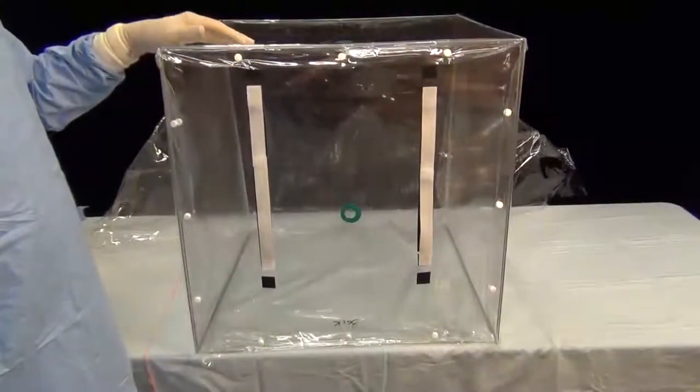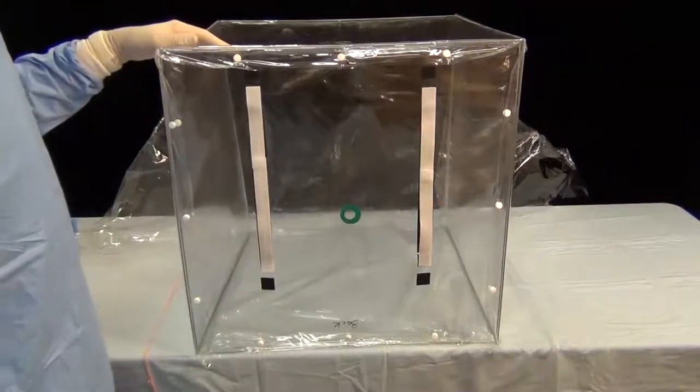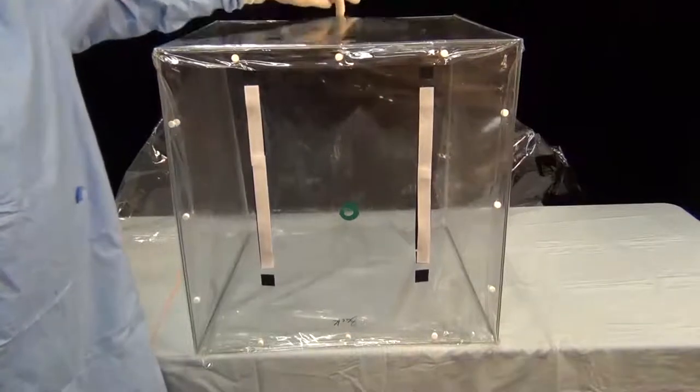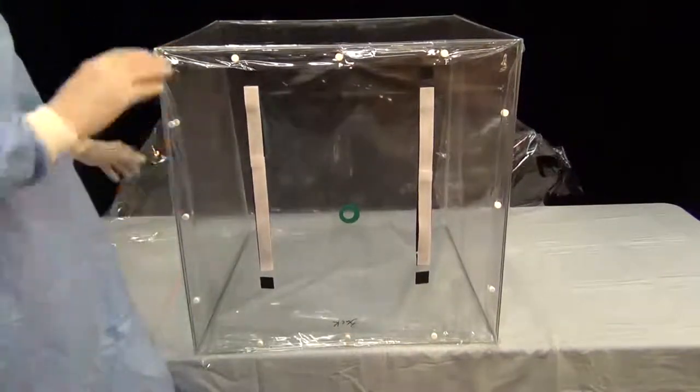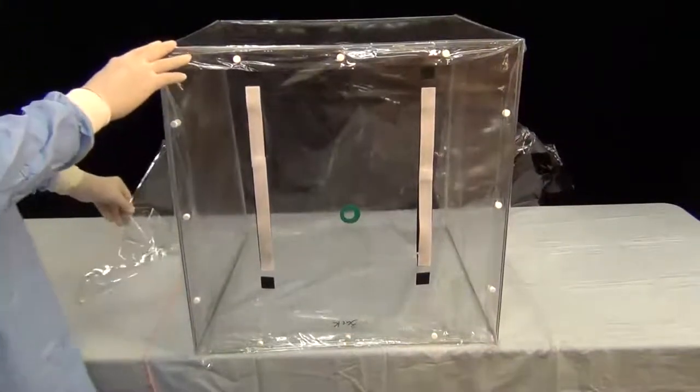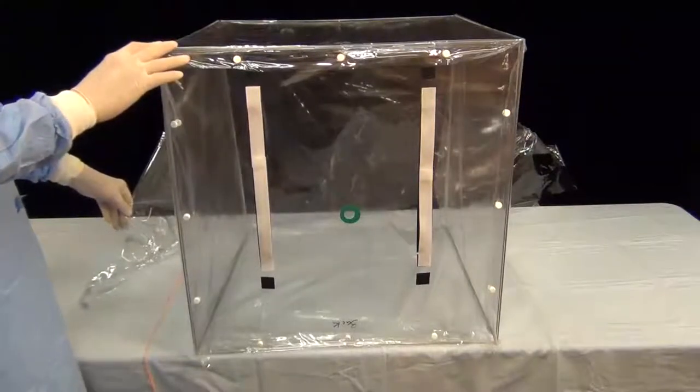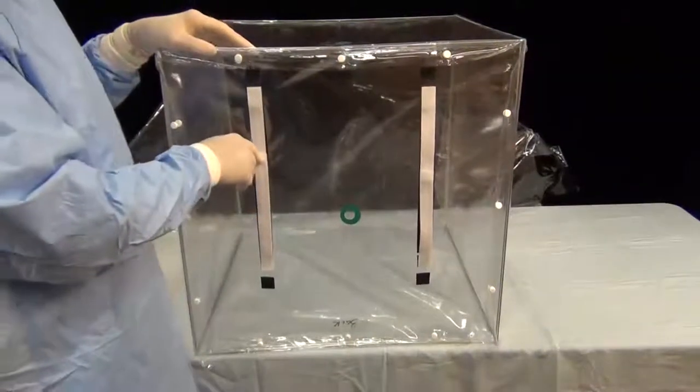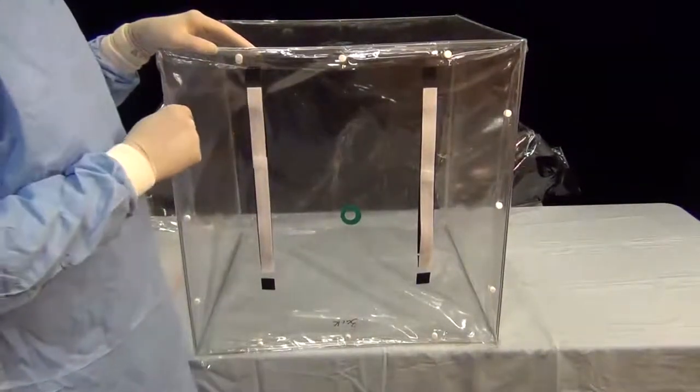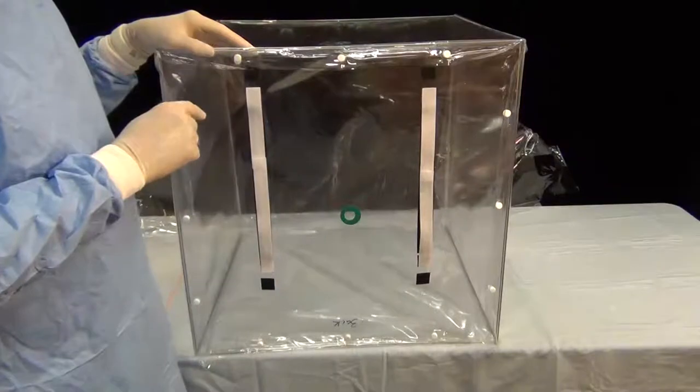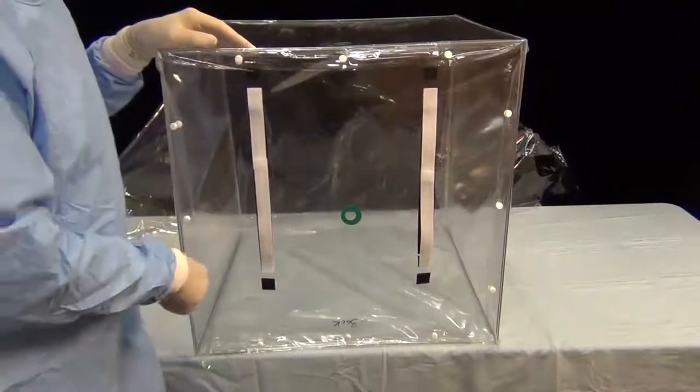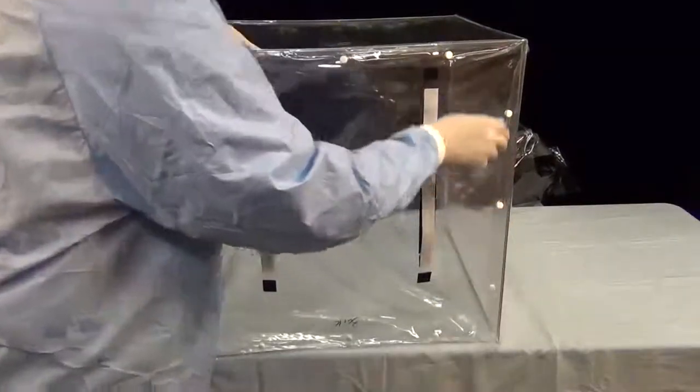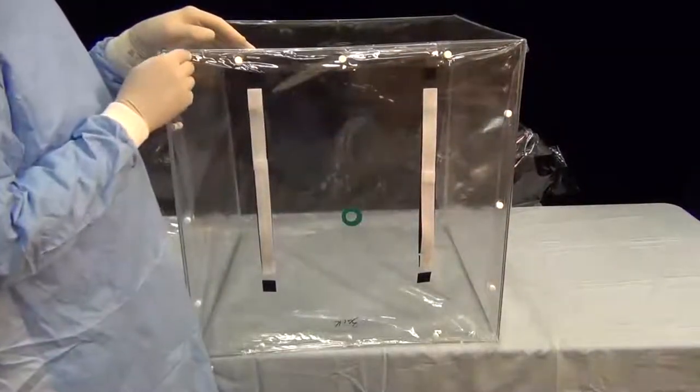We now have opened the tent. For your orientation, the top of the tent can be recognized by this opening in the top. The flap is toward the front or what will become the front of the tent. And the back wall, which is the one with the access ports, has already been attached for the most part at clips that cover the periphery of the tent.